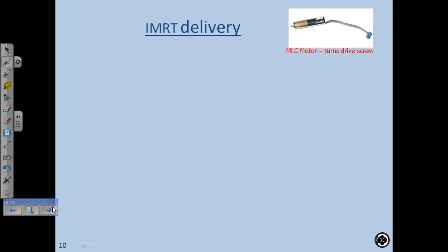If you make another immobilization device for the hand, the hand might be in another position. Okay, we're talking two different things. This compensator was placed directly on the hand. It's metal? No, it was plastic. Oh, okay, a plastic compensator. My apologies. Okay, so this makes sense, because then the compensator will fit right on the hand. Right. Yeah.